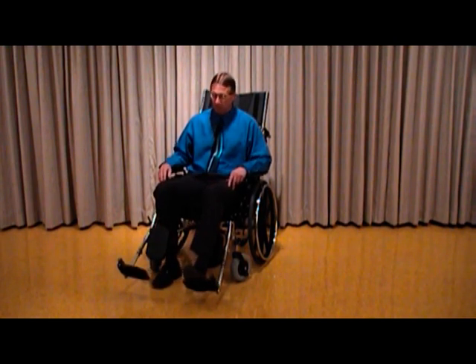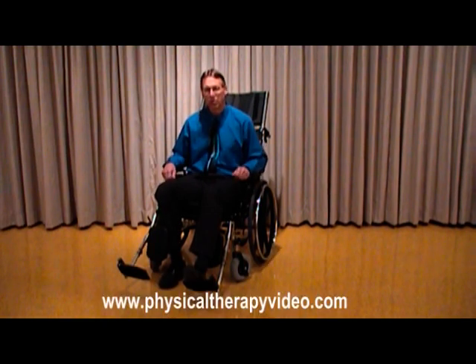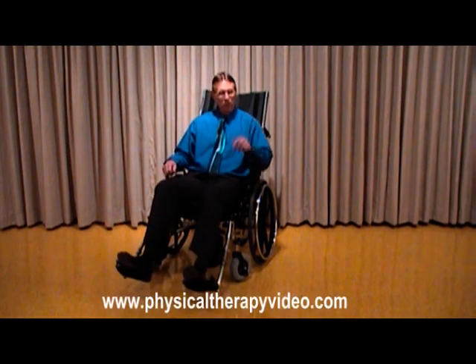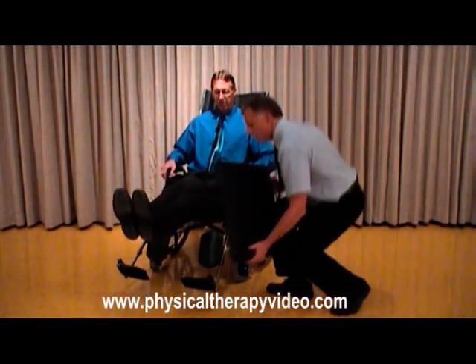Another piece of equipment you might want to consider is a calf rest. And this is good for the patient or the resident who doesn't have good leg control, and they have the tendency to drop their legs in between the leg rests. You're afraid they're going to get caught in there, they might get injured, especially as you're pushing the wheelchair. So Brad here will demonstrate how the calf rest can be put in place.